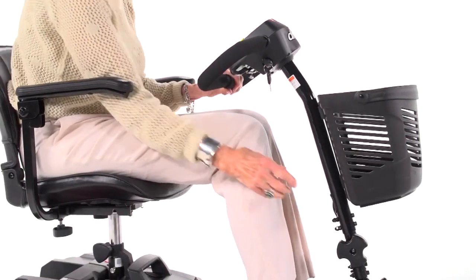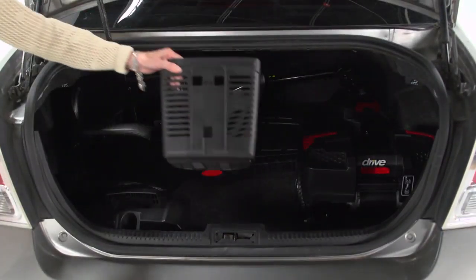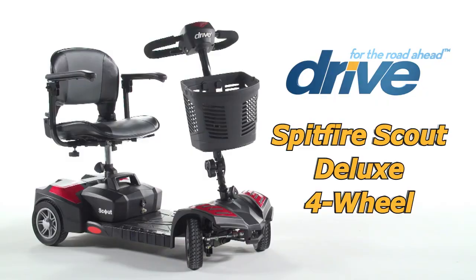Plus, the tiller's angle is adjustable to position the controls in the most comfortable driving position. You can always count on Drive Medical to bring you convenient and innovative lifestyle solutions, now and for the road ahead.